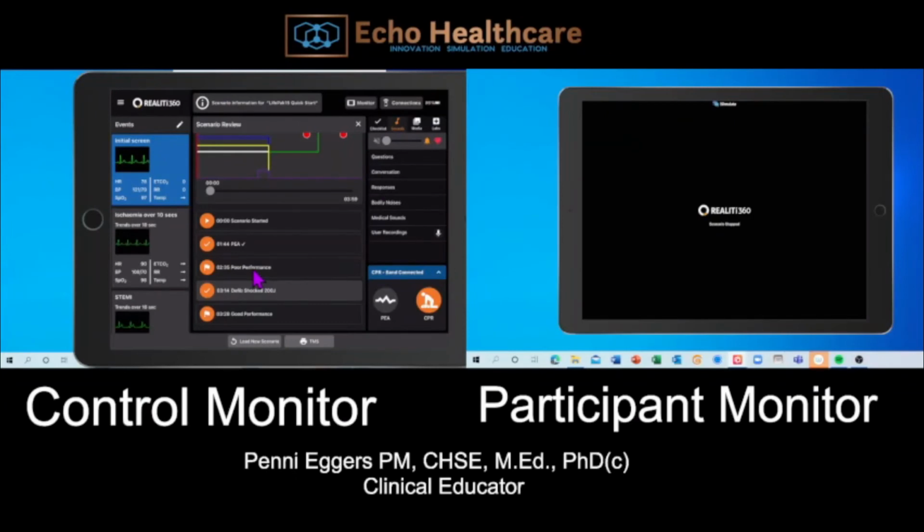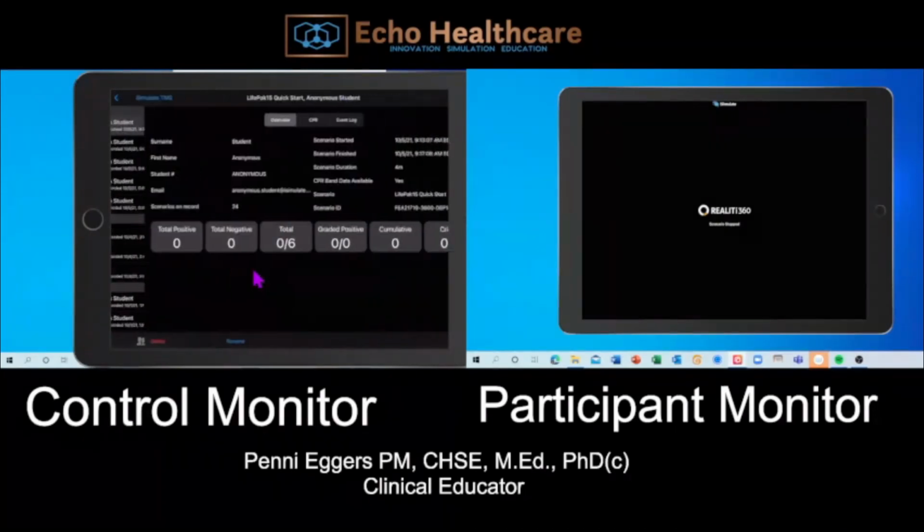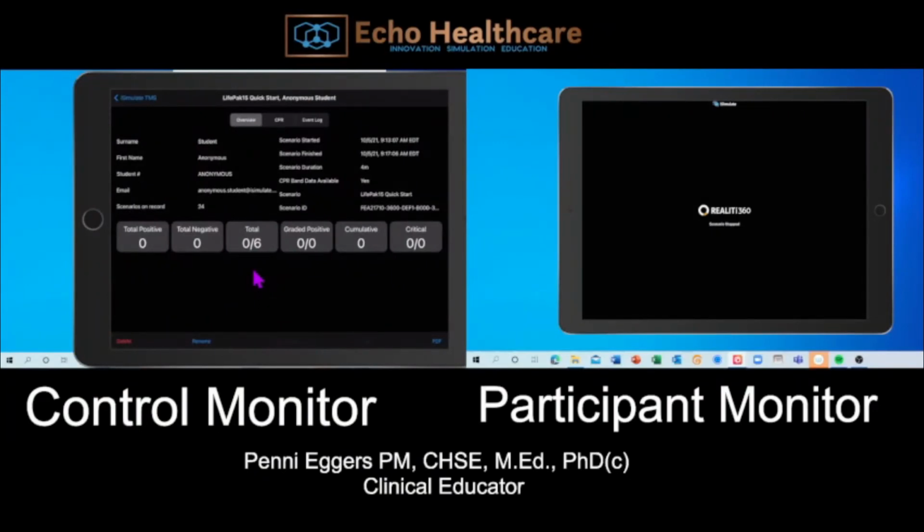If you go to TMS, you notice at the top of the page, that's where you can see what the student's name is, or the group name. That's why I thought it was important in the beginning to put some identifier in there so you know which scenario you're debriefing. If you don't put anything in, it's just going to say anonymous on there.